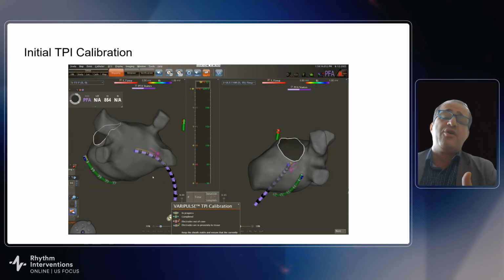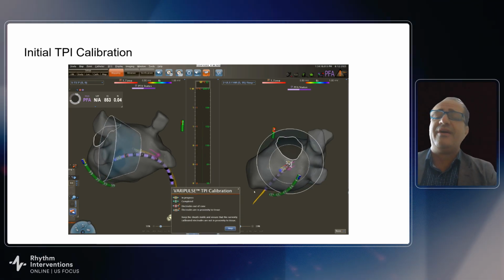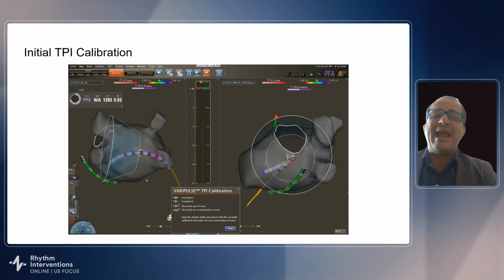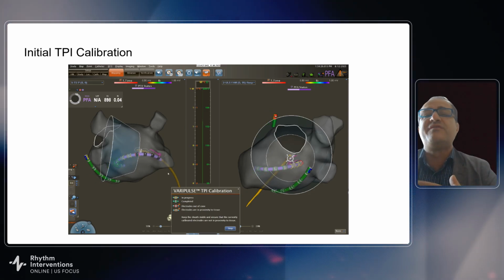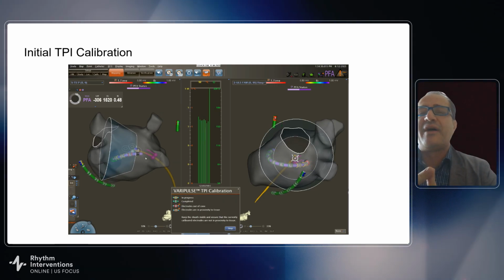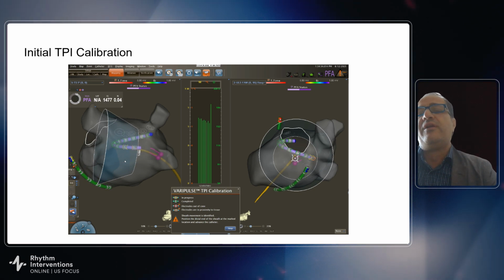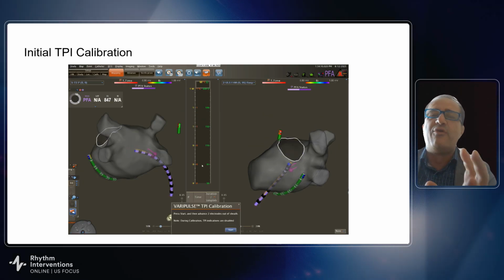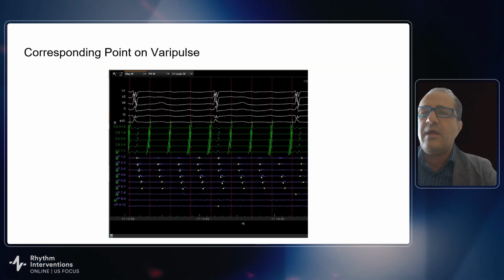We decided we cannot go RF, it's esophagus. So we went with the Varipulse. This is the training that you have to do for all electrodes. It's the equivalent of zeroing the catheter. Before, we only had to zero the tip of the catheter. Now we have to zero the full circle. And this cone was created to guide the movement inside an area where there is no contact with the anterior or the posterior wall.